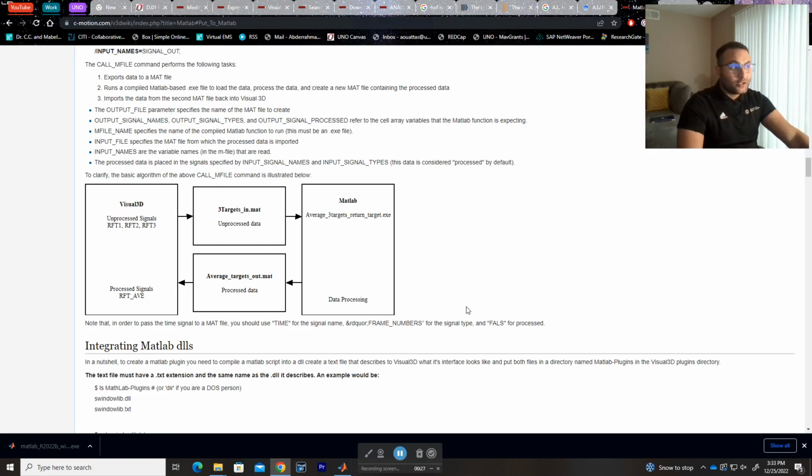So in this video, we'll talk about how you can export your data from Visual 3D to Matlab, complete any biomechanical analysis you want, or any statistical analysis, any filter, anything that you don't have access to on Visual 3D, and then import those data back in to continue doing your biomechanical analysis. So this is very helpful if you want to keep visualizing your data and run more specific biomechanical models or specific analyses in Visual 3D.